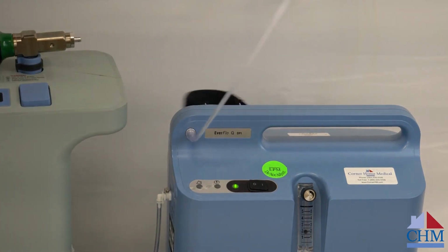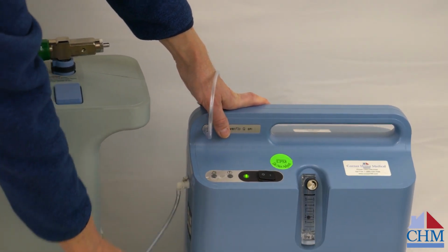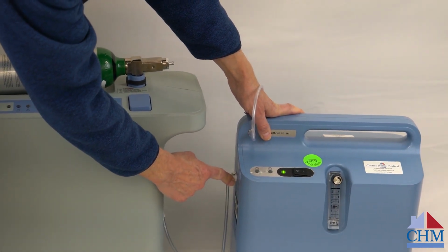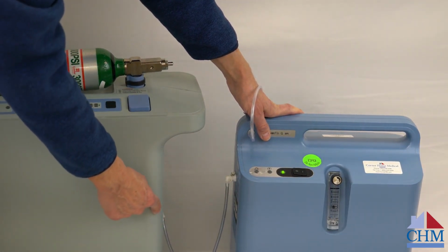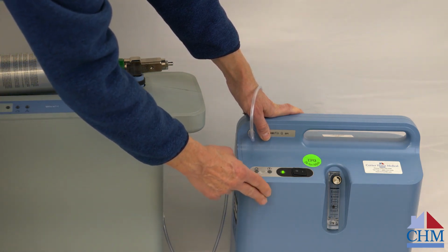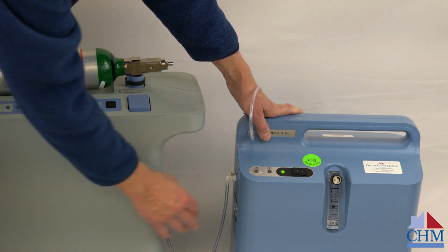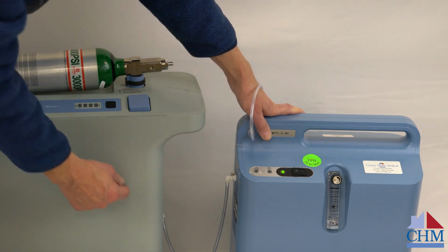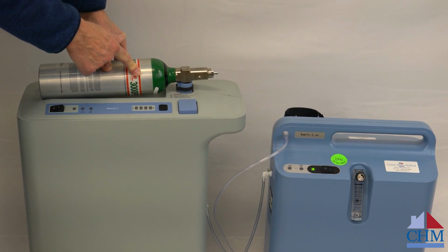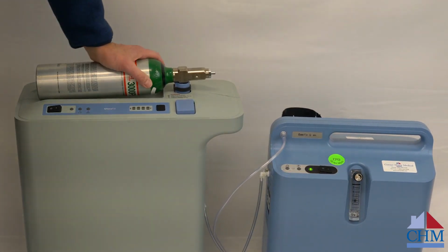Then you'll notice on this side of the concentrator, there's another tube, and this tube attaches from the concentrator over to the filling compressor. So it's important to note that the concentrator is the part that makes the oxygen. This does not make oxygen, but it takes oxygen through this tubing in order to fill the tank that's attached to the top.